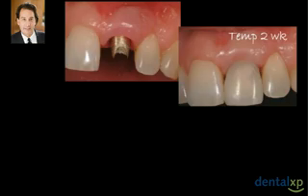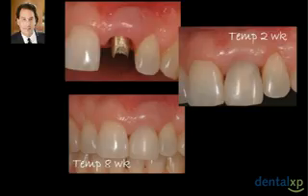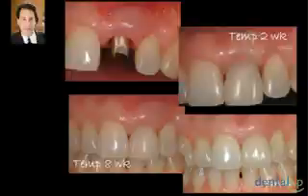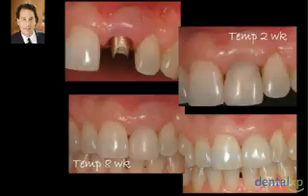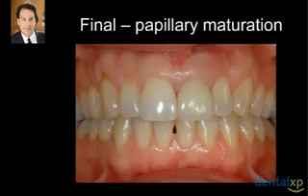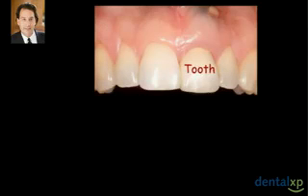If you look at this photograph, you can see the soft tissue starting to mature. We don't have complete papillary reformation distally, but it's getting there. Here's the provisional at two weeks — papillae are starting to reform but not completely, especially distally. At eight weeks, papillae are completely reformed, the soft tissue profile is nice, and we have good soft tissue labial to the implant. We go ahead to the final restoration about four weeks later. There is very little change between the final crown and the original crown.